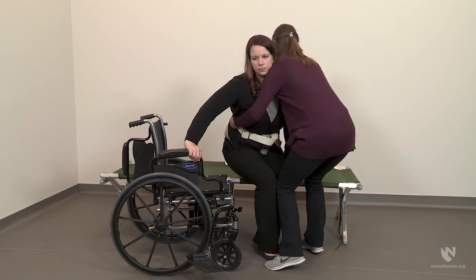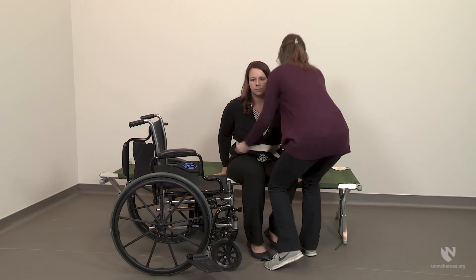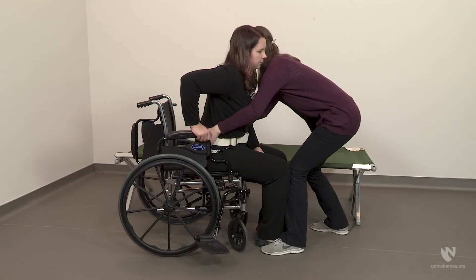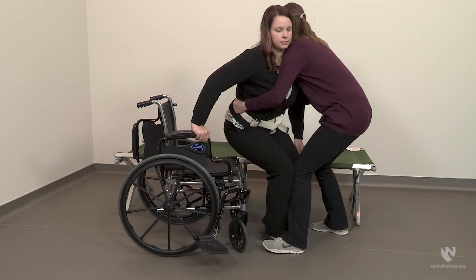Pivot to move the individual towards the cot. When rotating the individual towards the cot, make sure to rotate with your entire body. Rotating using just your back and trunk is likely to cause injury and should not be done. It is often helpful to say 'ready, set, lift' or 'one, two, three' so that you and the individual move in coordination.